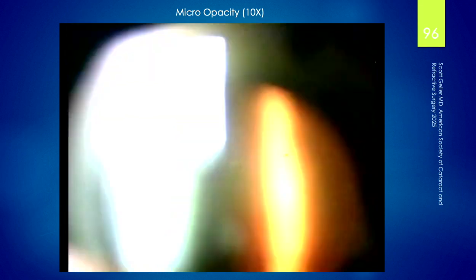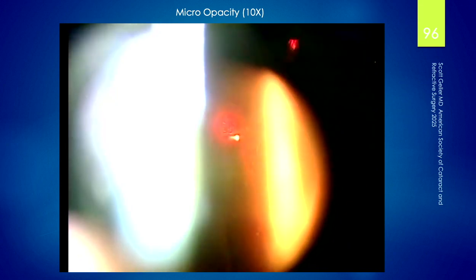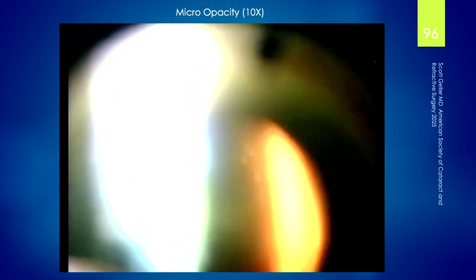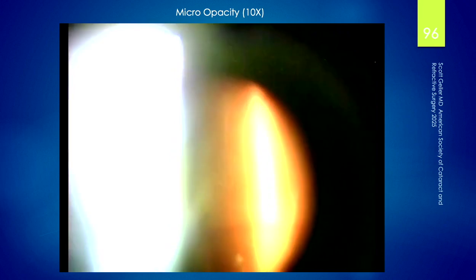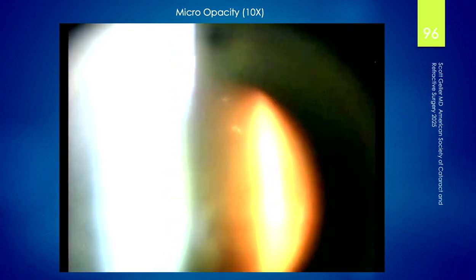Move the contact glass to make this thing come a little further forward. Things move in a pendular fashion. And ultimately, by cutting some of the invisible vitreous fibers that are keeping this opacity in its place, I got it. But like I said, you see the vessels back there, very close to retina. This thing's very mobile. You got to be very careful and know the limits of your laser.